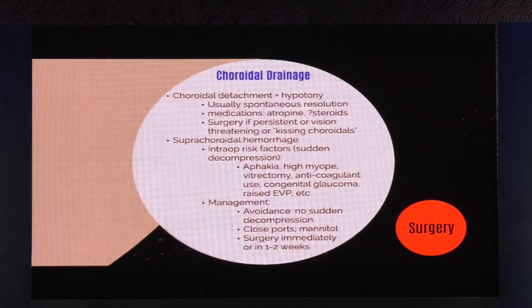I check the anterior chamber depth at the end of it, and that limits the flow posteriorly. Kind of reduces the bleb height, reduces the diffusion of the bleb, and keeps it going posterior, which is what we want. Some people do 3, 4, it depends on what you see on table. But this technique I find is much faster than having to open up the conjunctiva, go back in and mess with mucky tissue. And these are all mainly late bleb hypotony. So I find this technique much quicker, and I don't see what's the downside of trying this. Try this out.